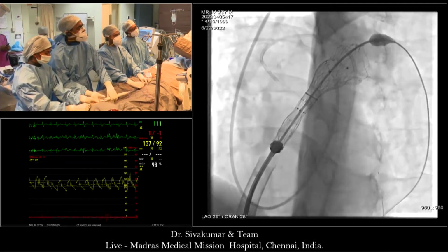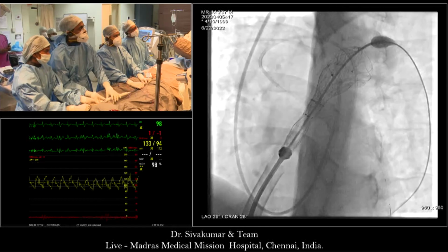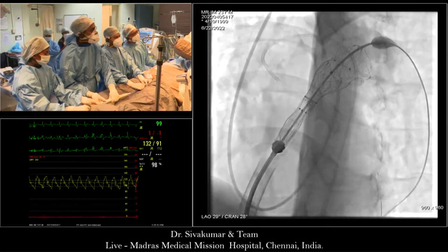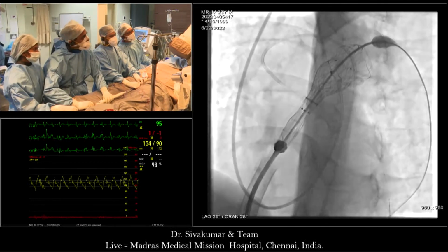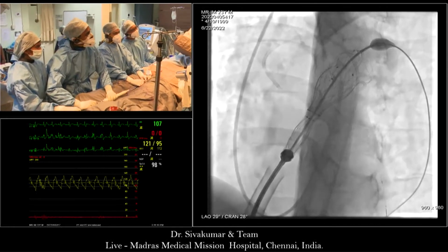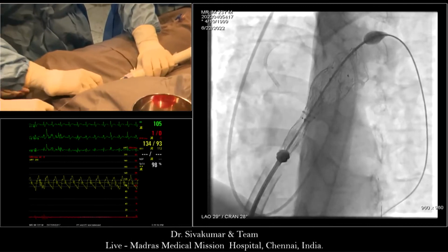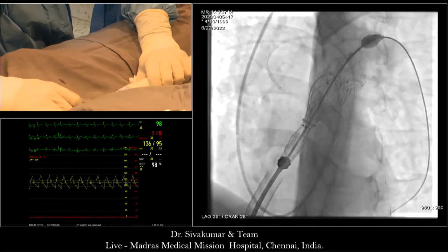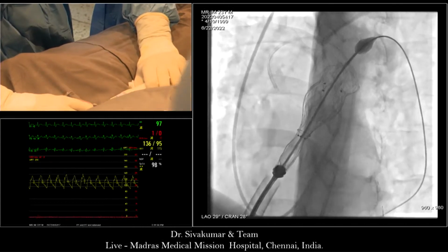This venous P valve is a self-expanding valve which in the constrained portion is very elongated, whereas when it opens out it shortens significantly. So it is better to go in because if you start deploying it very proximally.